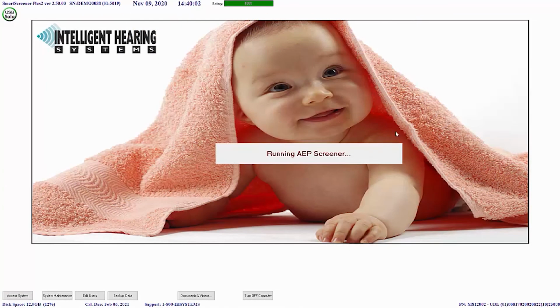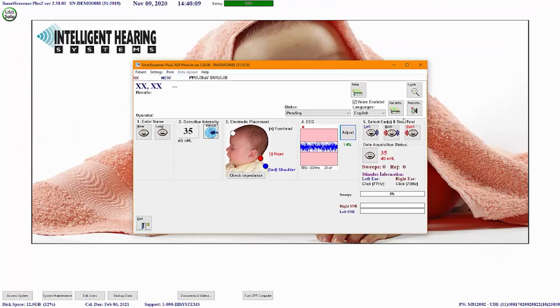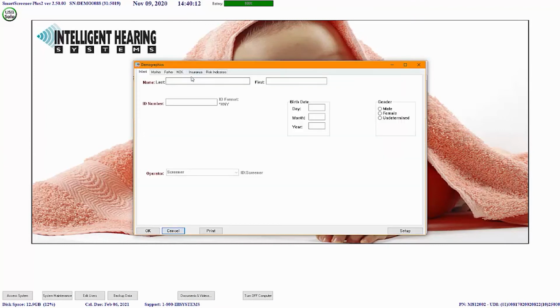Once the AEP screener is launched, the user will choose to either enter a new patient by clicking on New or open a patient that has already been entered into the system by clicking on Load. The required fields are customizable and are set up when the equipment is installed. Here, I will enter the last and first name along with the medical record number in the ID field.